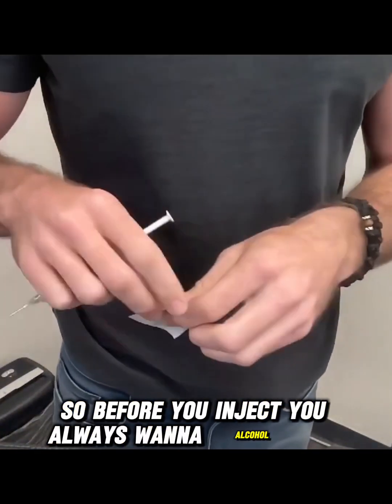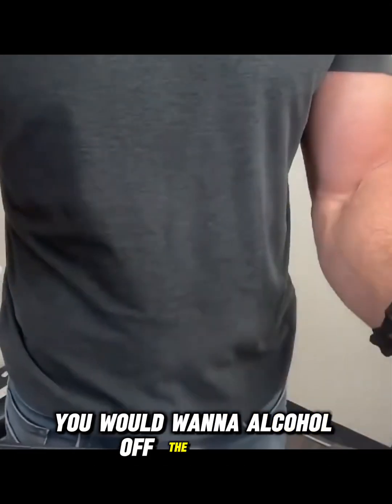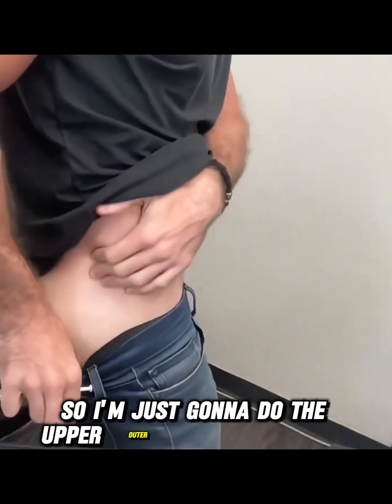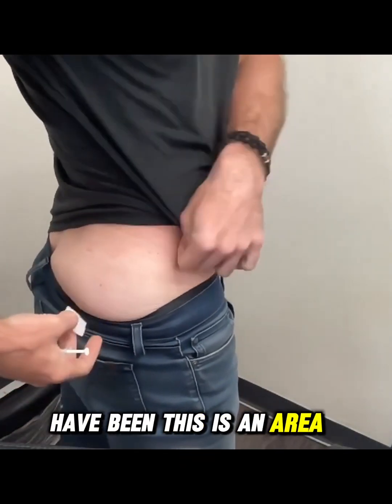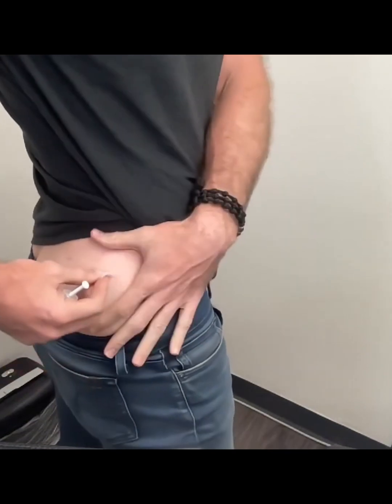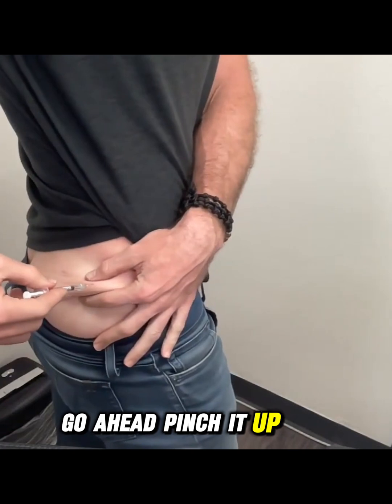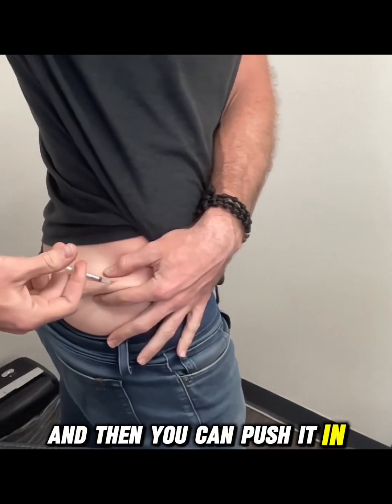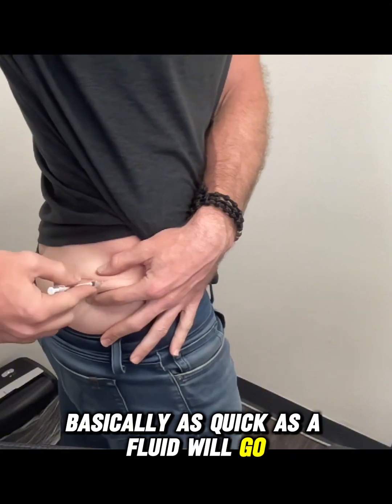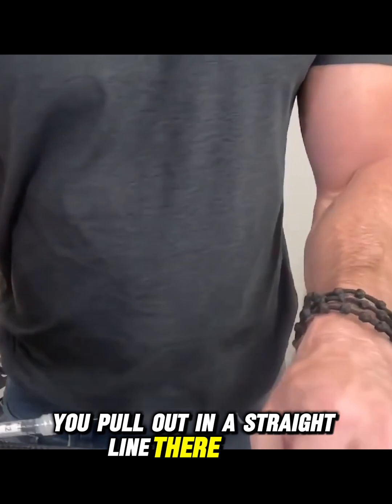Before you inject, you always want to alcohol the area. If it were a fresh bottle you'd also want to alcohol off the bottle. I'm doing the upper outer glute area — this is the area I pin most often. Alcohol the area, pinch it up, and then just dart it in. You can push in the fluid basically as quickly as it will go, and when you pull out just make sure you pull out in a straight line.